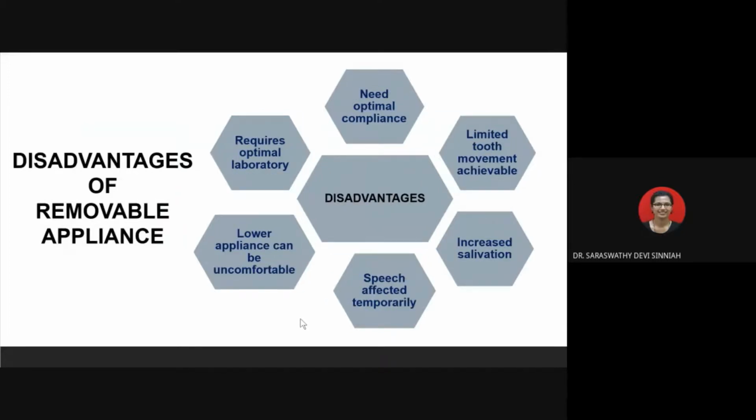However, there are several disadvantages associated with removable appliances. It is heavily dependent on the patient's cooperation to wear the appliance as instructed when they are away from the clinic. The outcome of treatment depends on the patient's compliance. Therefore, there will only be results if the appliance is worn as required. It is also difficult to carry out complex tooth movements. Correction of teeth that requires bodily tooth movement or severe derotation is difficult. So the possibilities of treatment are somewhat limited with the removable appliance.